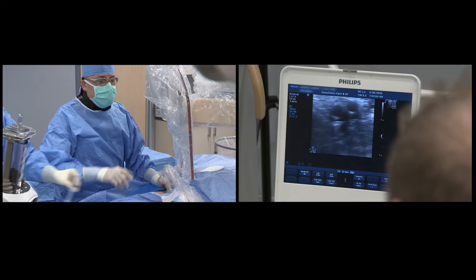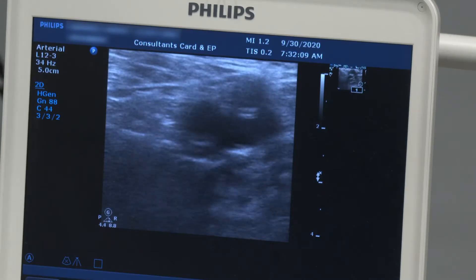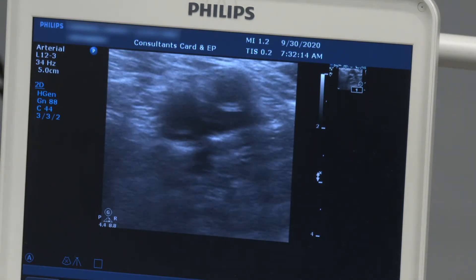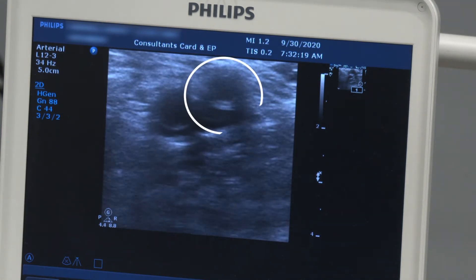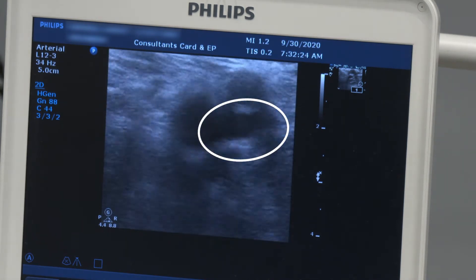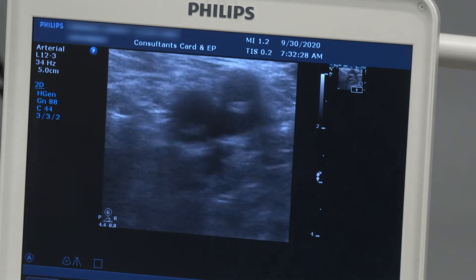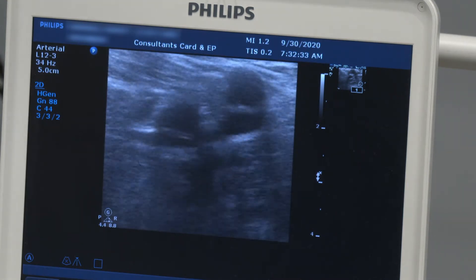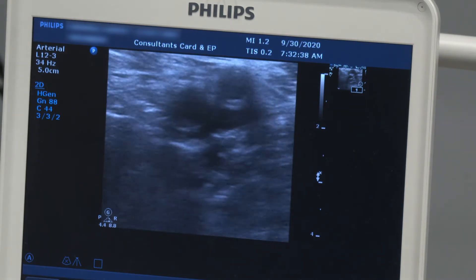On the ultrasound, this is called the Mickey Mouse sign. You can see a circle around seven o'clock, a circle around twelve, and a compressible circle in between the two. This is like a Mickey Mouse head with two ears — the head and the little nose — which represents literally the entrance of the great saphenous vein.